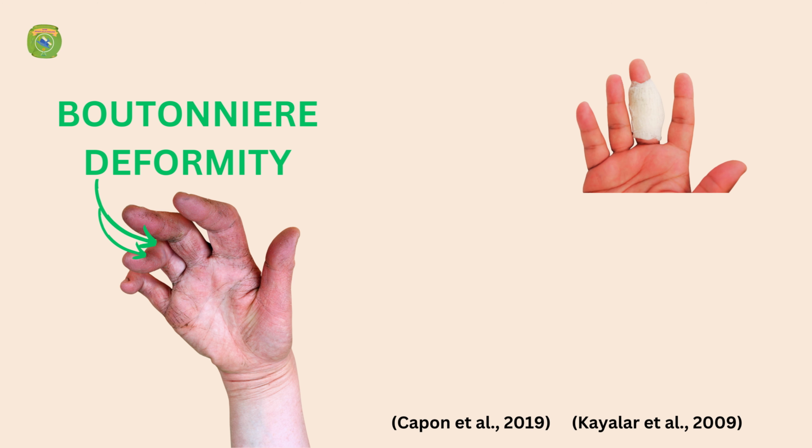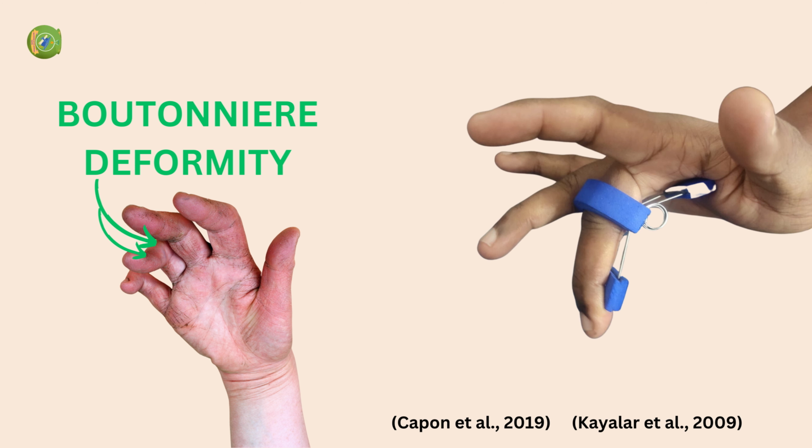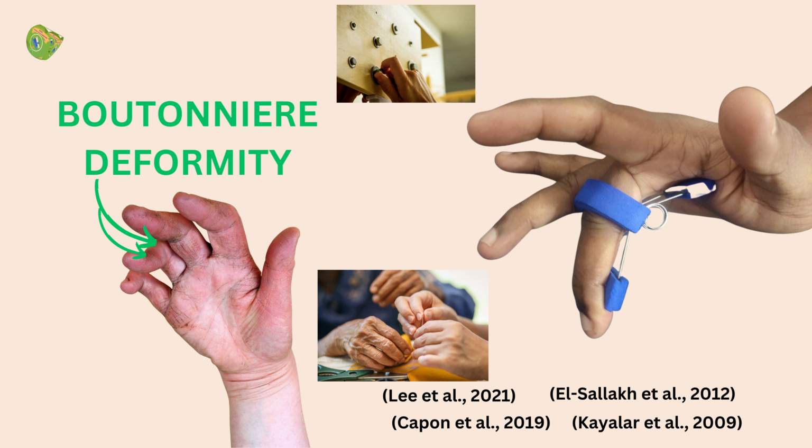static volar finger splinting is given for only the PIP joint for the initial 4 to 6 weeks for an acute closed injury, and weaning off from this splint is done with the use of a volar night splint for a further 2 to 4 weeks or more if needed, and a Capener splint during the daytime or while undergoing hand therapy. Dynamic splinting is sometimes given post-operatively as well. It may be around 4 to 6 weeks when hand therapy commences. In neglected, established cases, this splint is sometimes used to improve the joint mobility pre-operatively as well as while undergoing a comprehensive hand rehabilitation program.